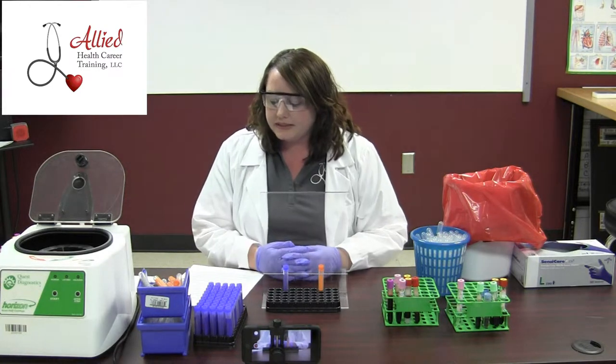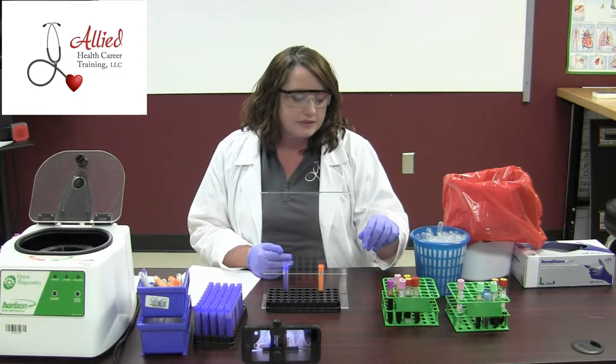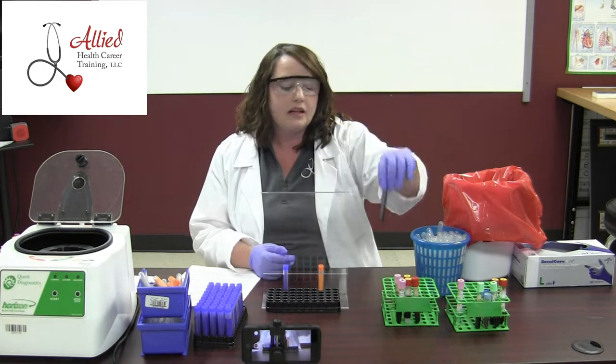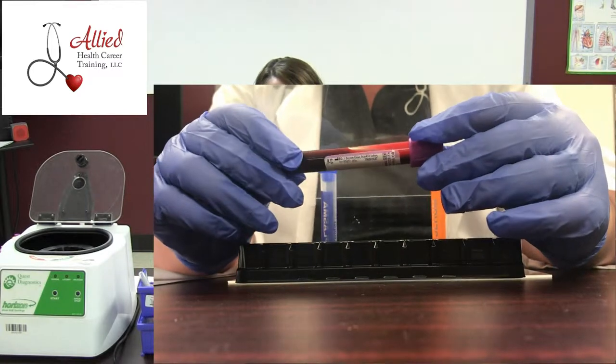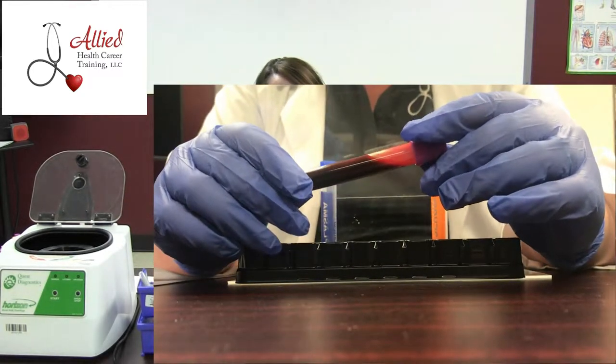For laboratory testing purposes, we need to make sure that we preserve our blood, so we add additives to our tubes. Some tubes have an anticoagulant in them, and some tubes have a clotting factor. Coagulation means to clot; anticoagulant means not to clot — so it's kind of a blood thinner.